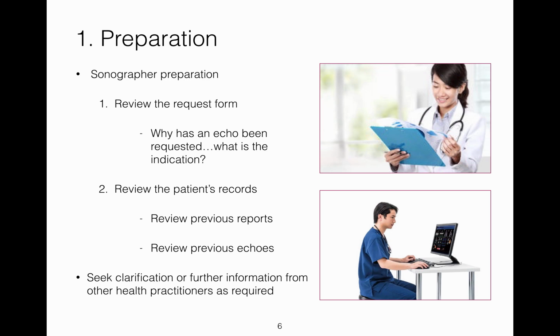At times, the referral may not provide many details, so it's important to review any previous correspondence about the patient. If the patient's records include previous reports and/or previous echoes, these should be reviewed prior to commencing the exam. Again, if you aren't clear about the reason for the exam, seek clarification.